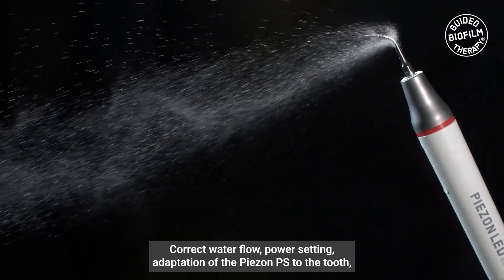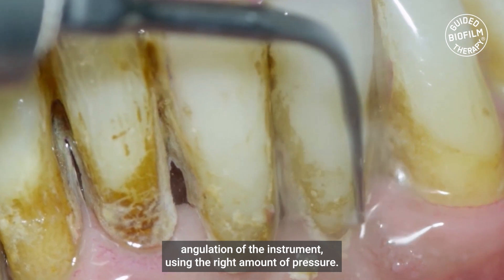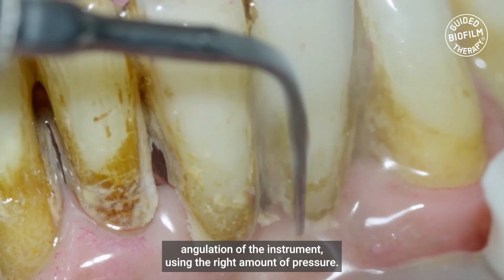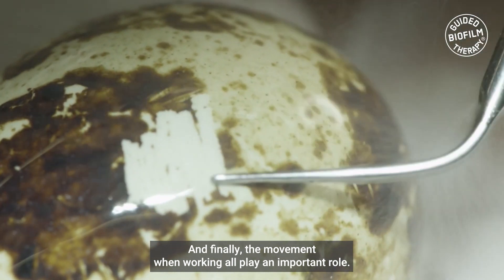Correct water flow, power setting, adaptation of the Piazon PS to the tooth, angulation of the instrument, using the right amount of pressure and finally the movement when working all play an important role.